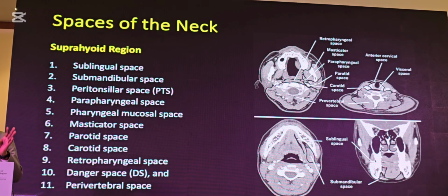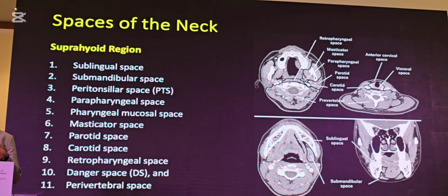When you are seeing almost the part of the maxillary sinus along with the posterior side, we are almost posterior. And these are all still images. When you see the diagram, you will be able to appreciate clearly when you run through anterior to posterior. But in still images like this, these are all the comparative structures to understand whether we are anterior or posterior. Here it is almost posterior, where you are seeing both sublingual space and submandibular space.